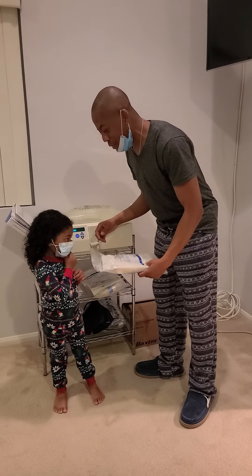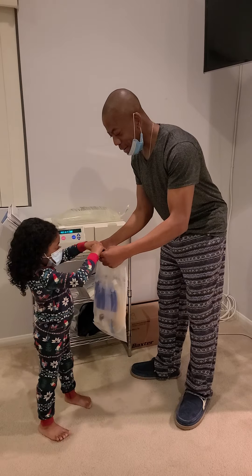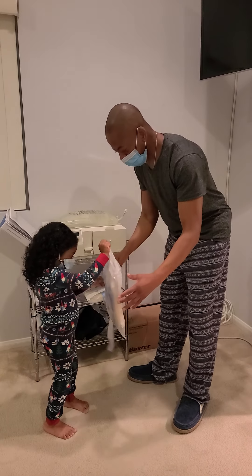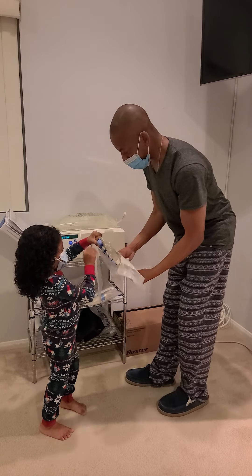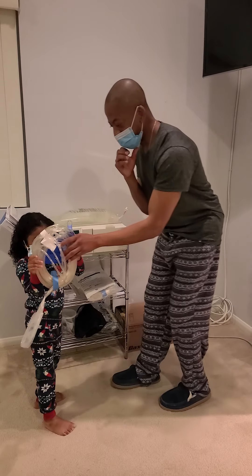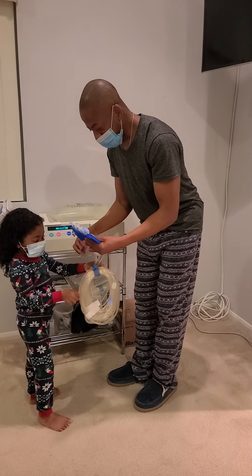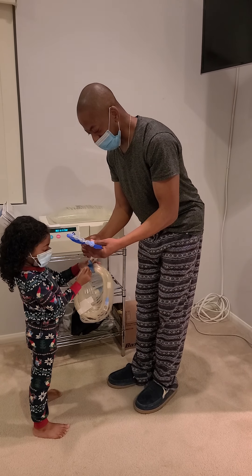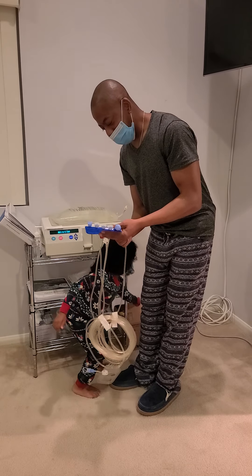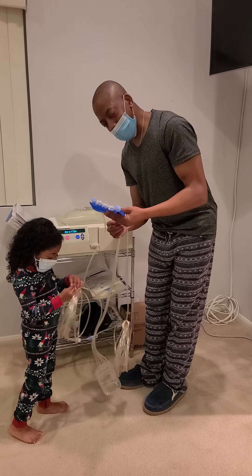So we're going to first open these. We've already cleaned our hands. We'll go ahead and open that up. And this is the cables that we're going to use. Zane likes to help and she's three. So if a three-year-old can help, we know this is something that is doable.